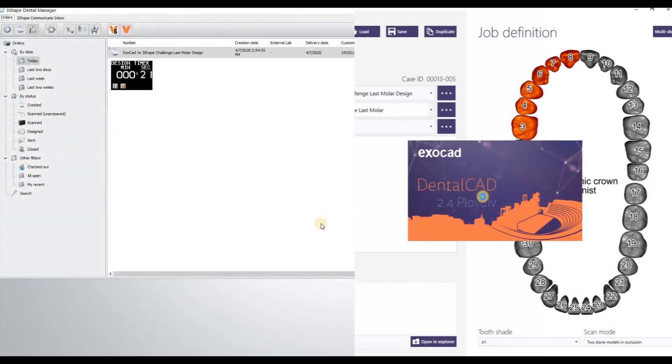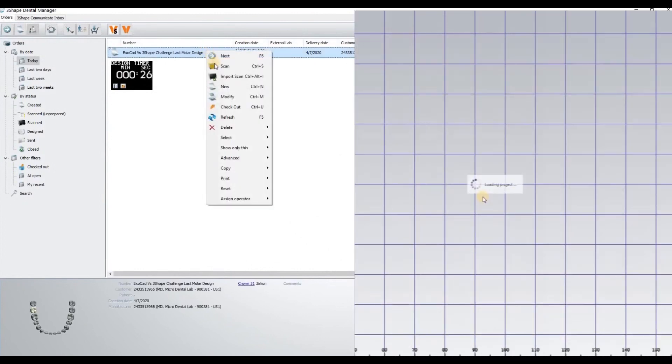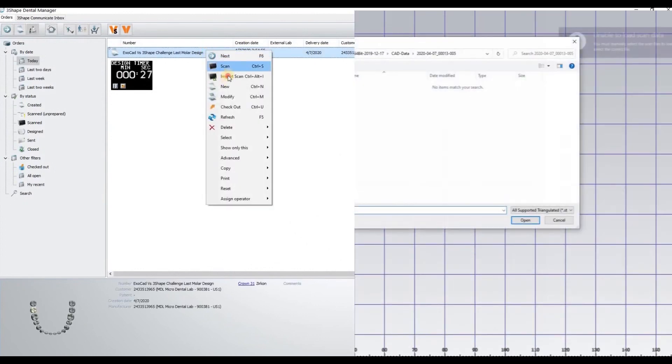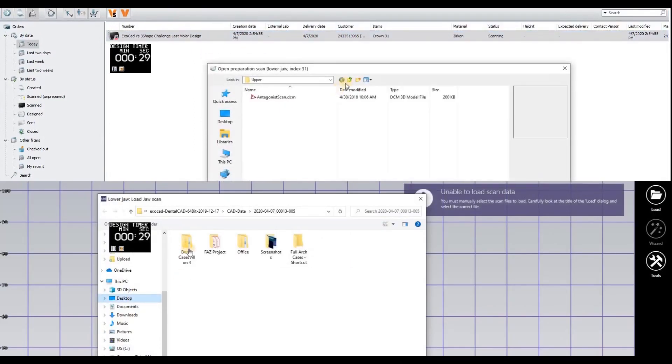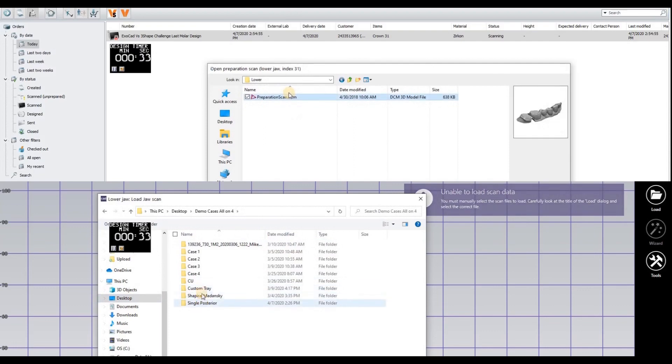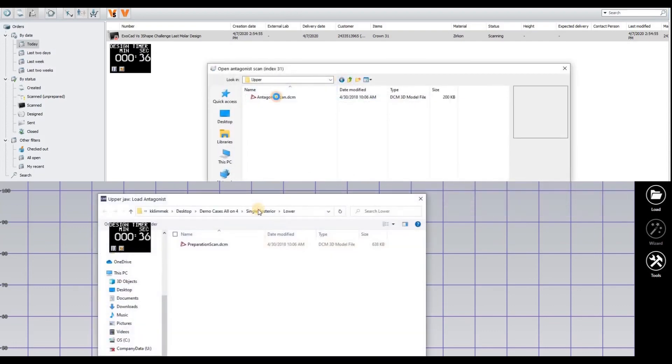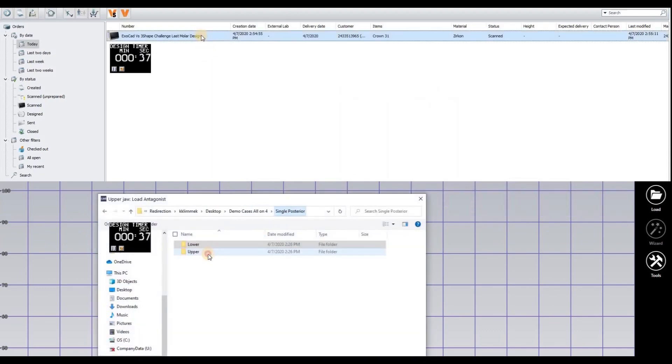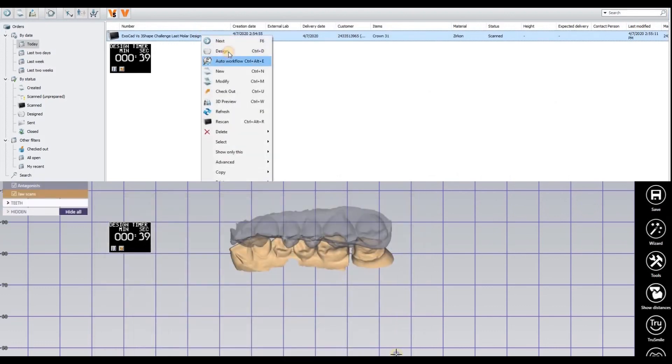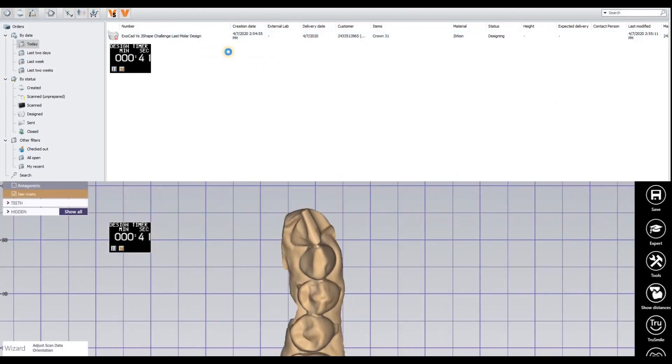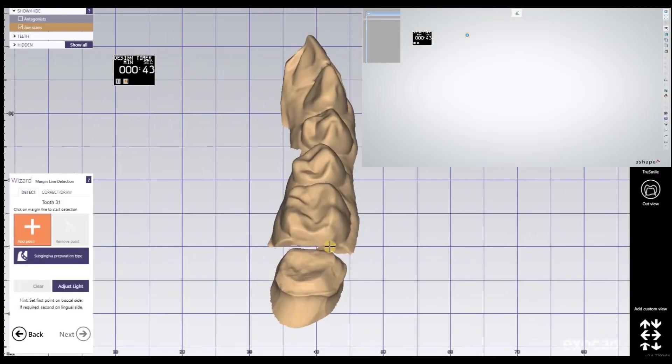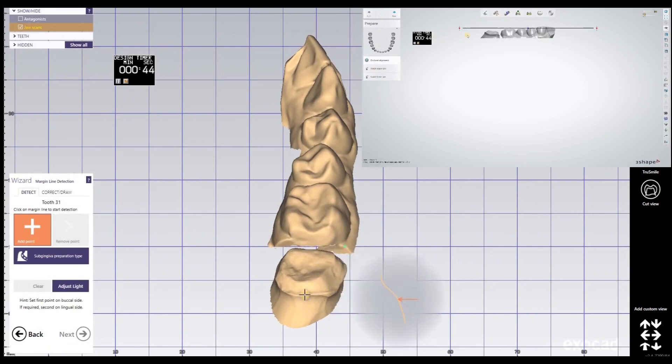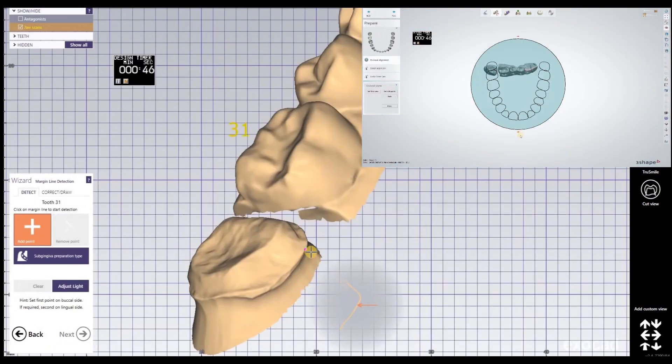Exocad is already loading the scan. To import the scans in three shape, I have to do it manually. Both softwares do basically the same - you have to import the scans: first the preparation scan, then the antagonist. Exocad is a little bit faster, maybe I was a little bit faster with clicking.